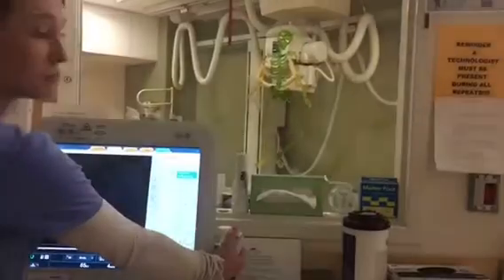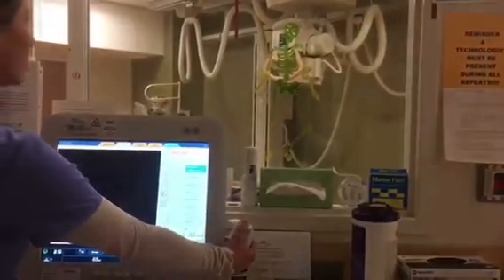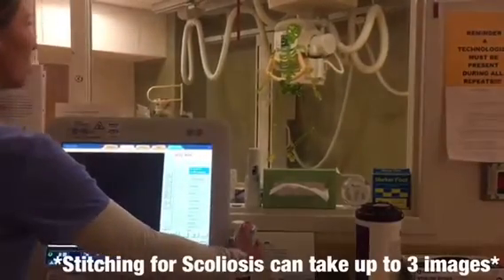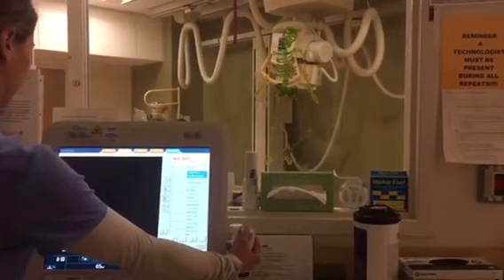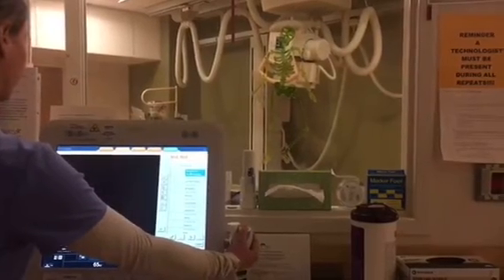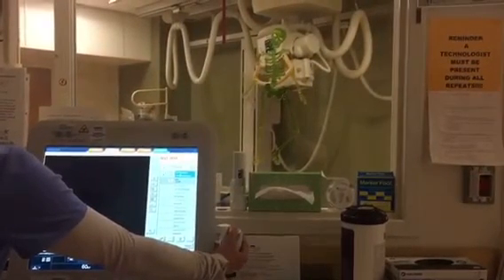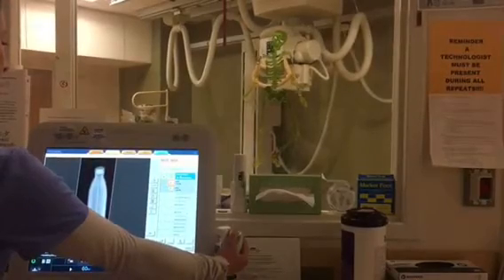All right, I'm going to take the exposure now. I have to see that not only one image is taken, but 2 have been taken. And you'll hold it down until the tube is in neutral position. One image. 2 images.